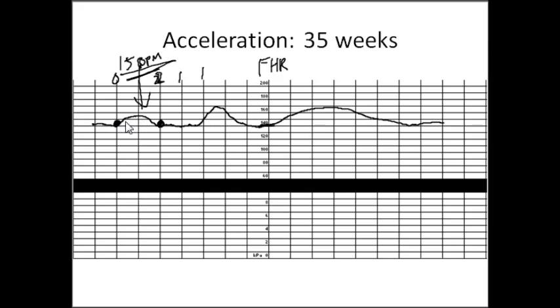Each one of these is going to be a minute. This would be over a period of almost 60 seconds, and then return back to normal another 60 seconds. That's definitely more than 10 or 15 seconds. This one, it's going to have a greater increase, but really it's going to be the same thing. It's more than 10 or 15 beats per minute for a longer period than 10, 15 seconds.